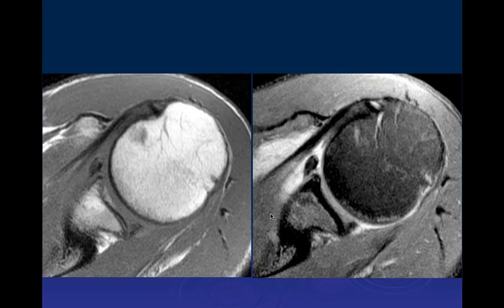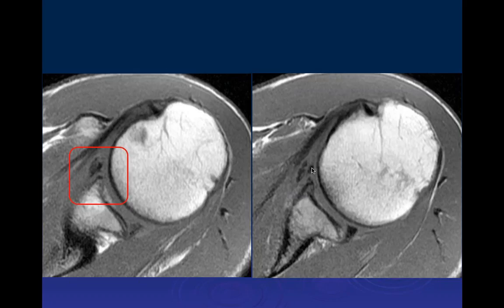I'm seeing what I believe, at this level, is the anterior band of the inferior glenohumeral ligament, just superficial to the anterior inferior labrum. So this could be the anterior band of the inferior glenohumeral ligament or the middle glenohumeral ligament. We'd have to follow it up and down to see where it goes. So that's the area we're concerned about.